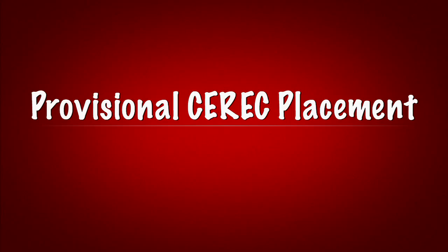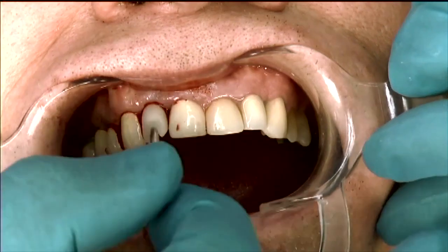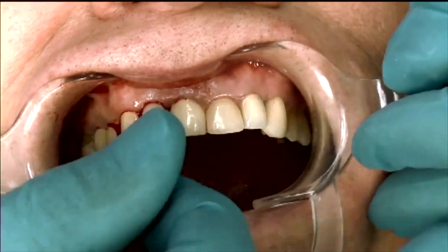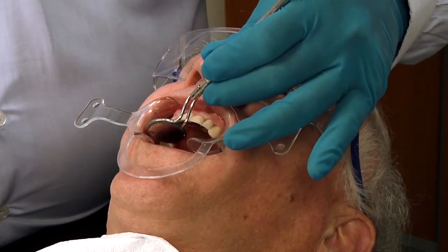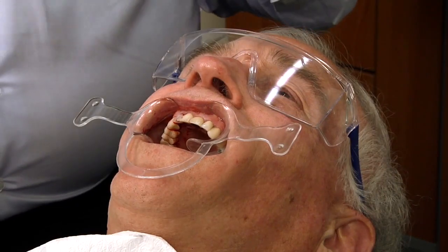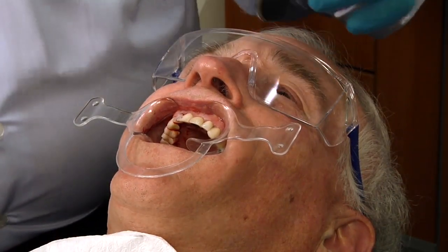We have the implant temporary screw and we'll just literally place that right through the hole and hand torque that in. For this we're going to put a little bit of cotton into the access and then put a little bit of composite.